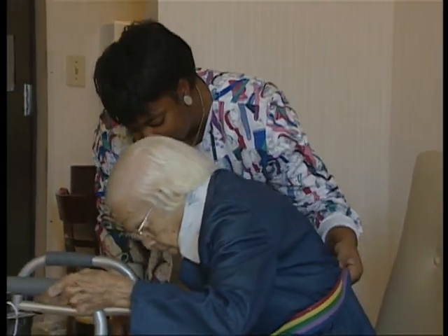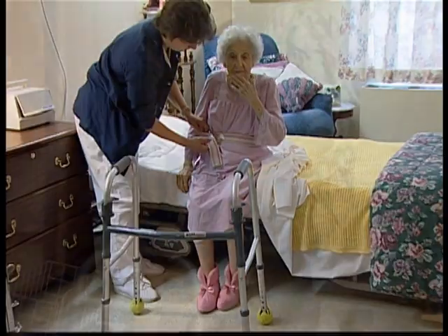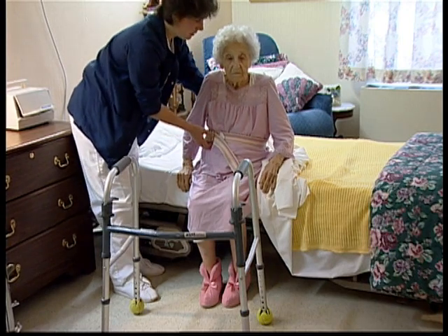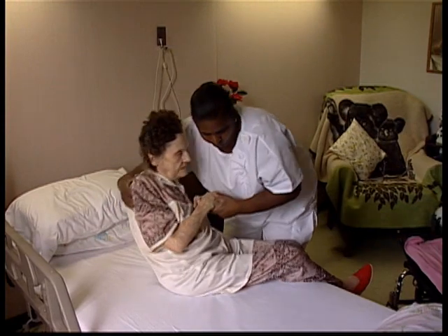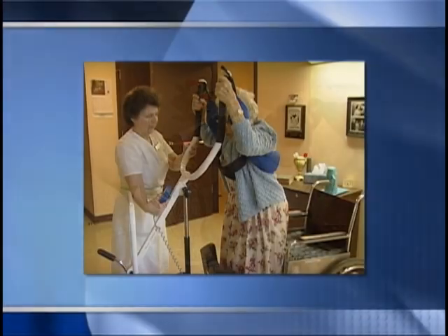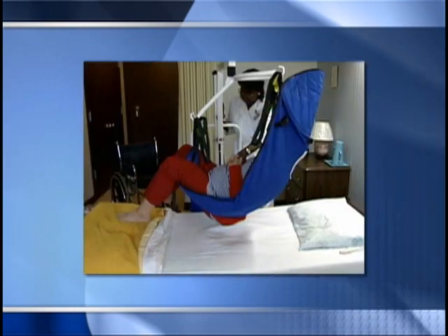Understanding how to transfer a resident safely can reduce the risk of falls and other accidents. Additionally, it can prevent injury to the caregiver, such as back strain and muscle pulls. As a nurse aide, you can help protect yourself from injury when you use proper lifting and transferring techniques. In some cases, a mechanical lift should be used for the safe transfer of residents who are heavy or who are in a weakened state and have little or no mobility.